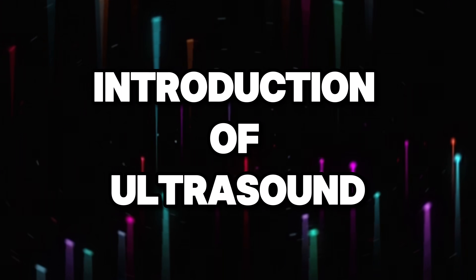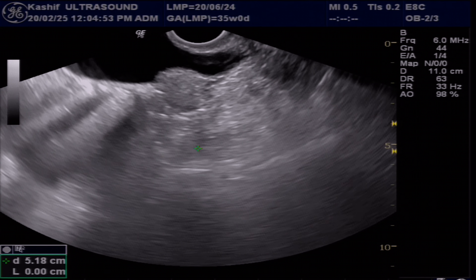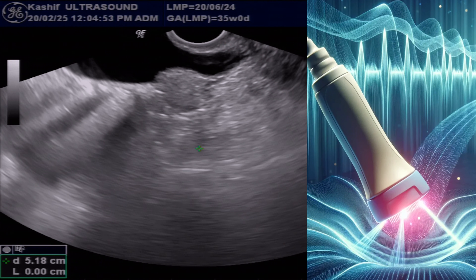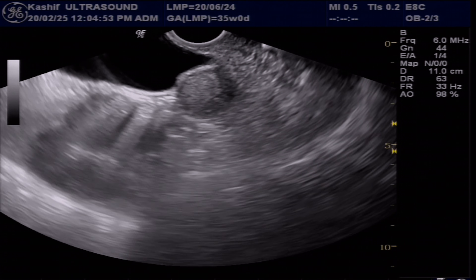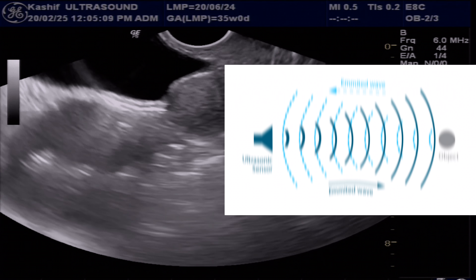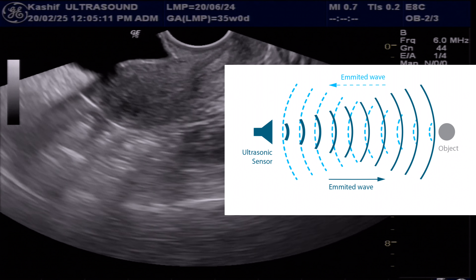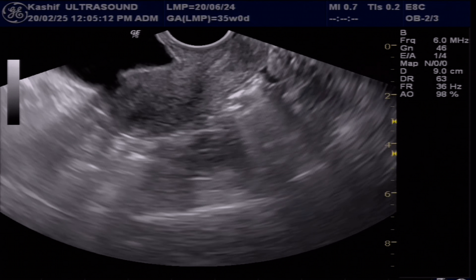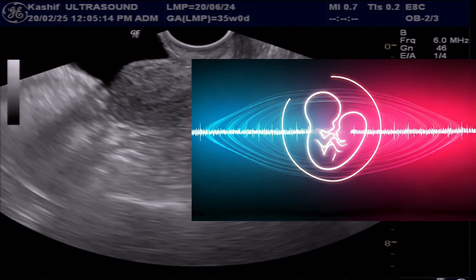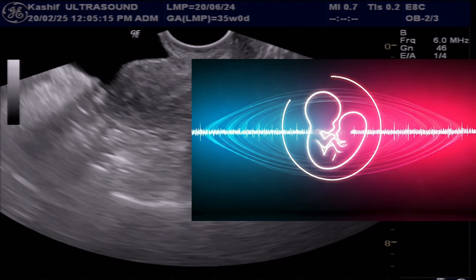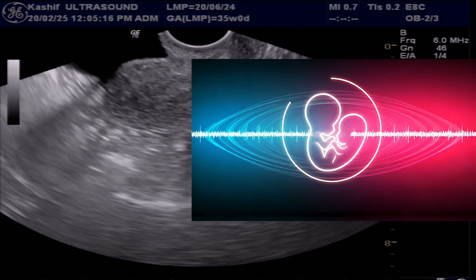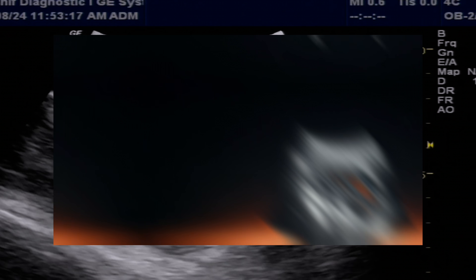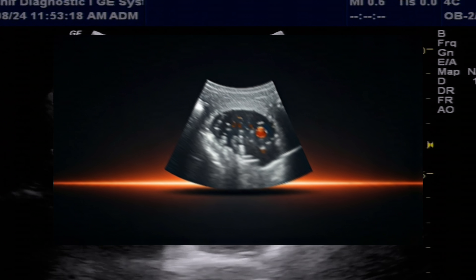Ultrasound is a non-invasive imaging technique that uses sound waves to create detailed images of the internal structures of the body. It is safe and cost-effective and does not involve radiation. Ultrasound can capture live movements of the internal organs and blood flow.